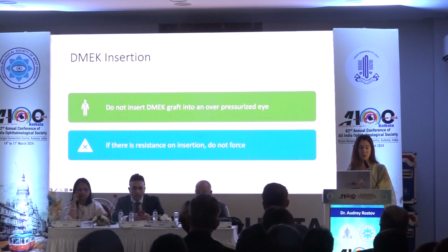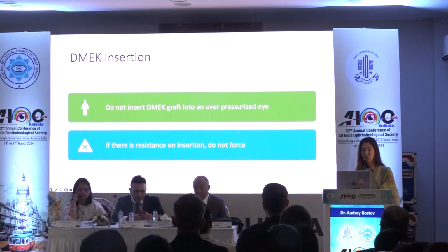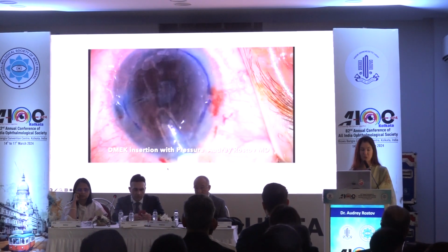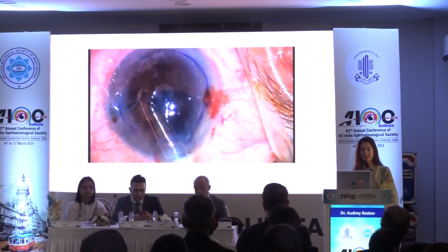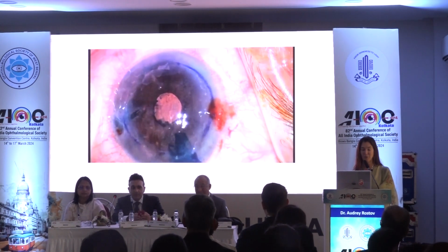Another tip when you're doing DMEK insertion, do not insert a DMEK graft into an overpressurized eye. If there is resistance on insertion, do not force it. Again, I did not heed my own advice right here, and I'm pushing and I feel resistance, and I still feel resistance. And what happens? There we go. Yeah, that's kind of a bad day when that happens, so you want to avoid that.